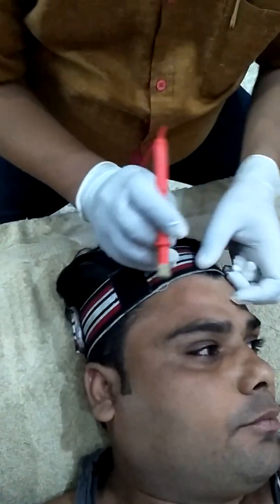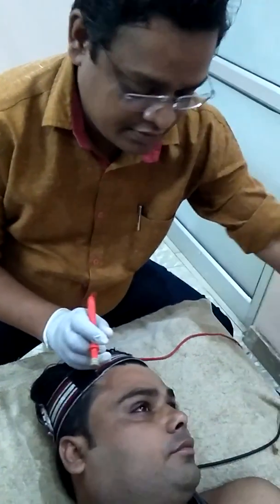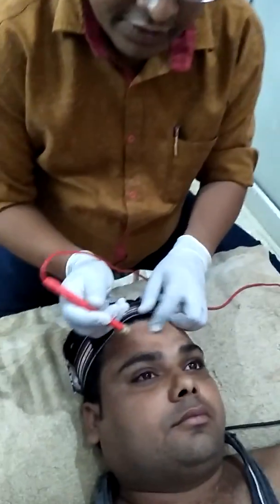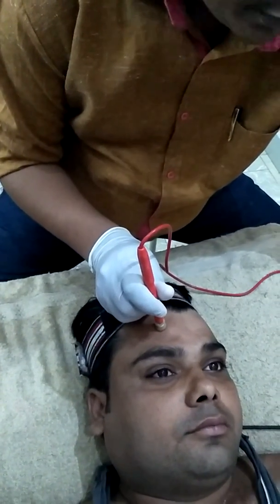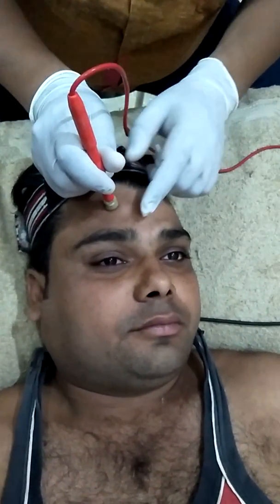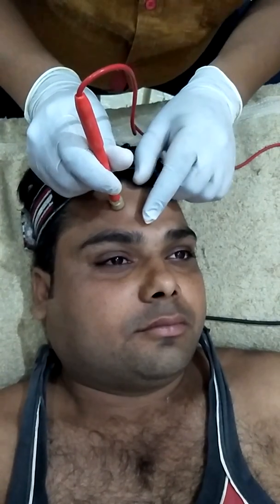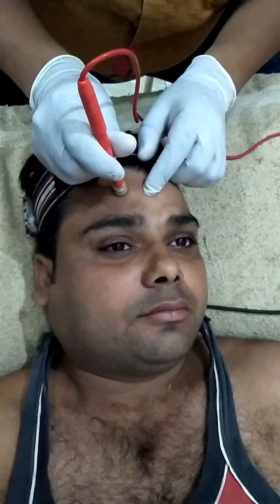This is the frontalis muscle motor point. Okay? Okay. You see the contraction of the frontalis muscle.